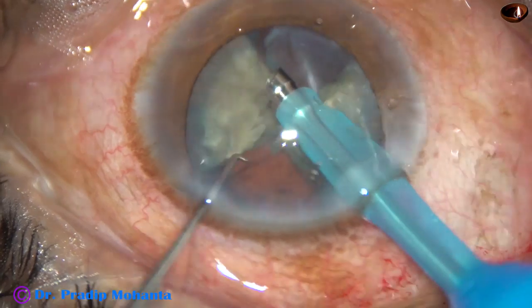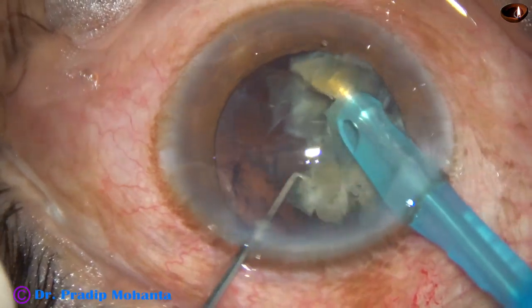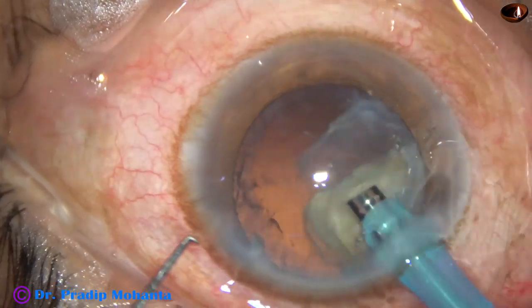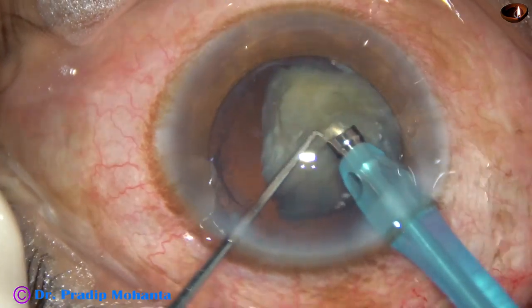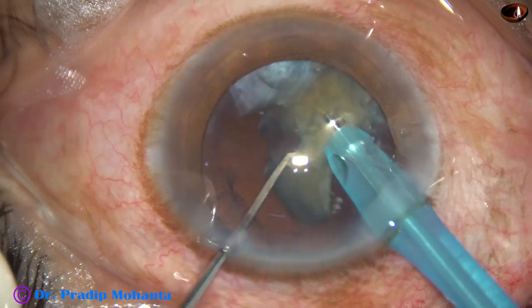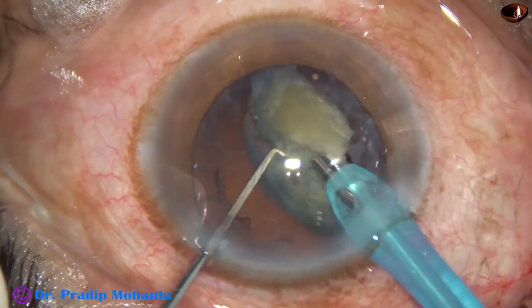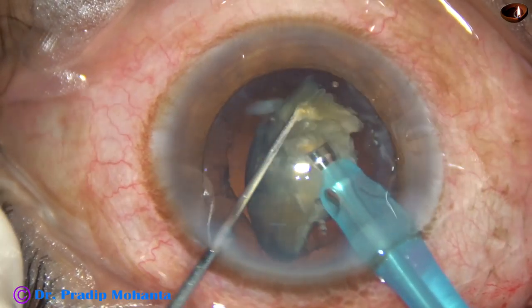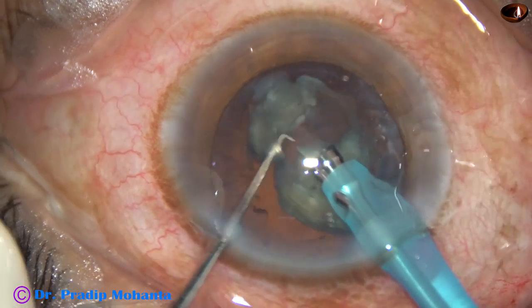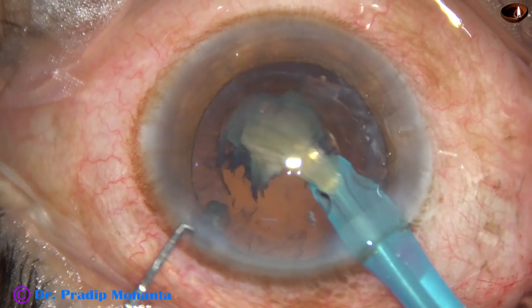One hemi-nucleus has been removed. This is a fragment of the other hemi-nucleus. These large fragments are emulsified starting from the apex — the central pointed part is the apex.